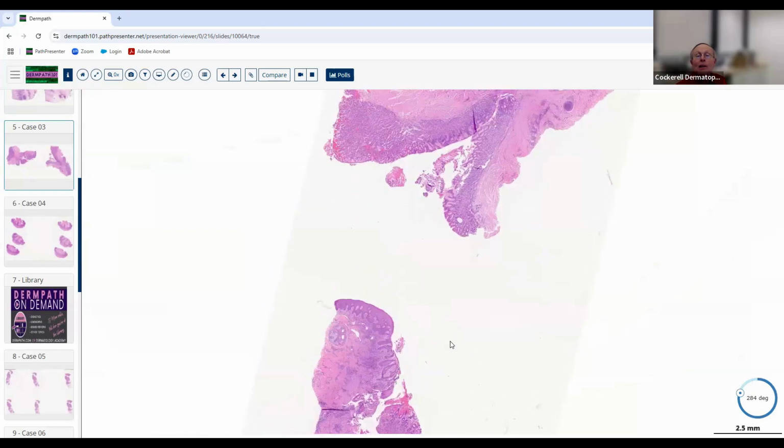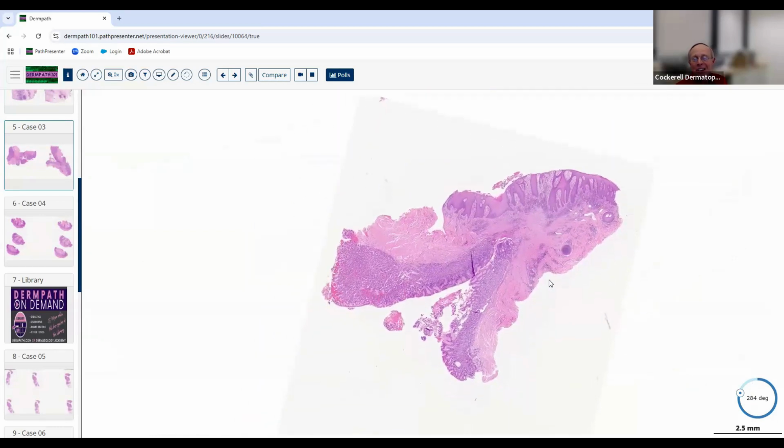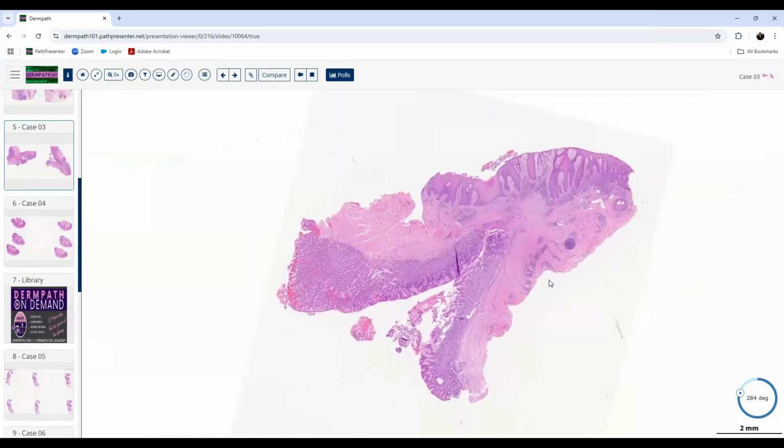Now we get something interesting. Hi, good morning. I can take this one. Okay, great. This looks like maybe the shape is irregular, so maybe an excisional biopsy. Okay. We noticed that it wasn't like normal epidermis. We thought maybe it had some GI mucosa in it.